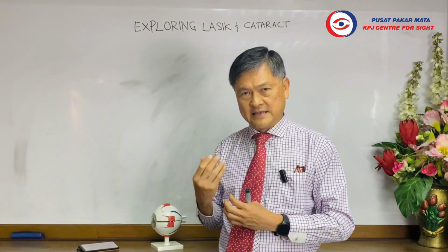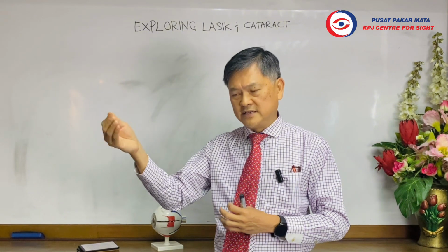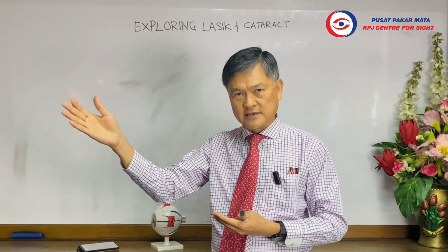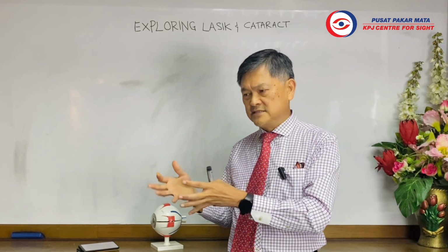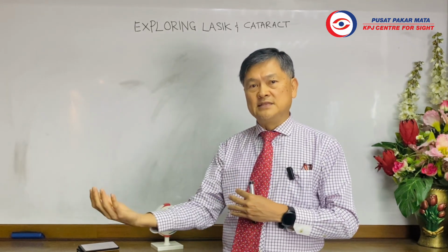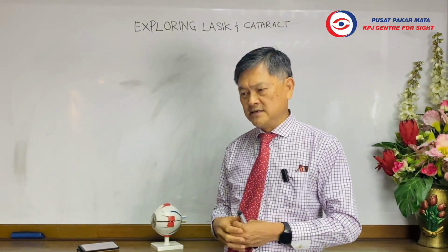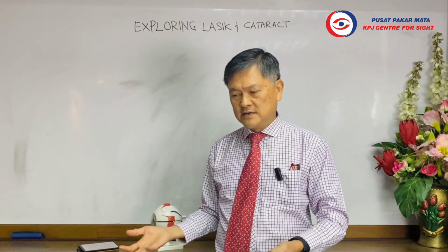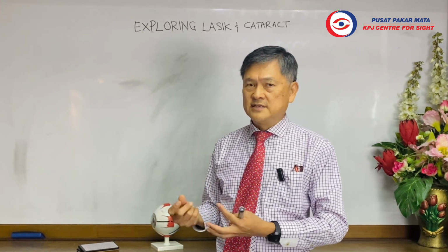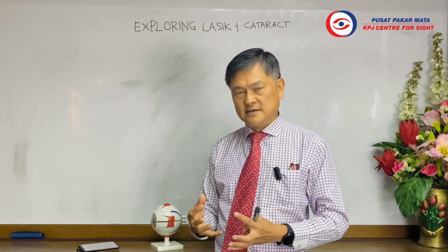This is called a mono lens. The mono lens allows the patient to see either far well, and then they need reading glasses, or see near well, and then they need glasses for far. Then there are lenses that give good distance vision and also intermediate, far and intermediate. This will be very good for patients who do housework, cooking, and only use a handphone. They can see far, and these are more intermediate activities.